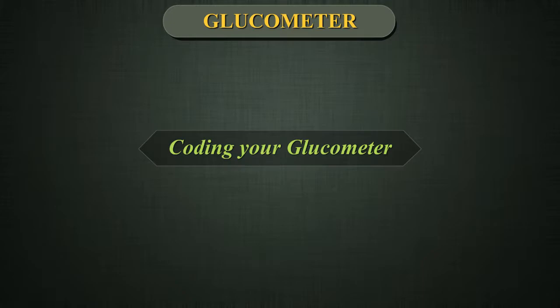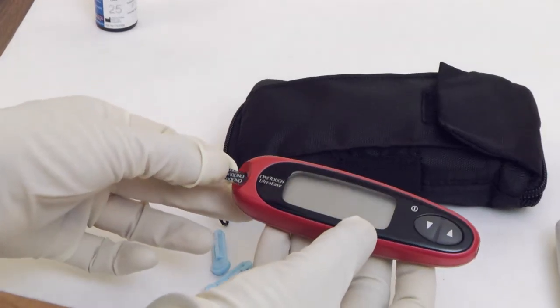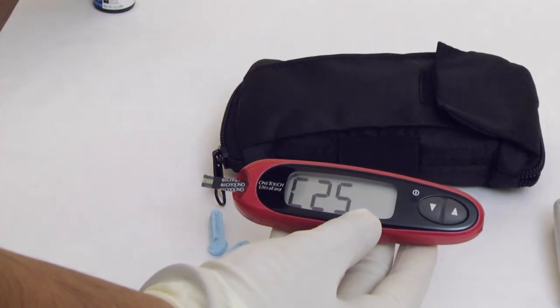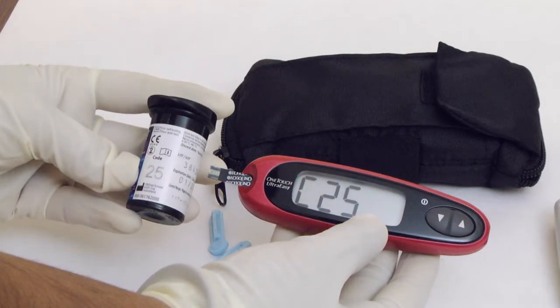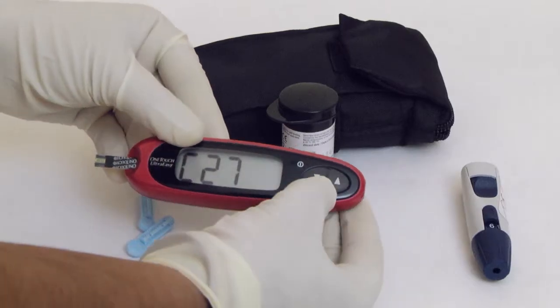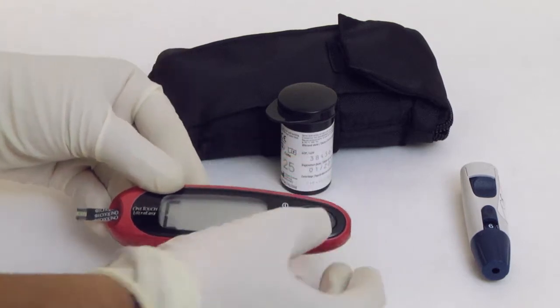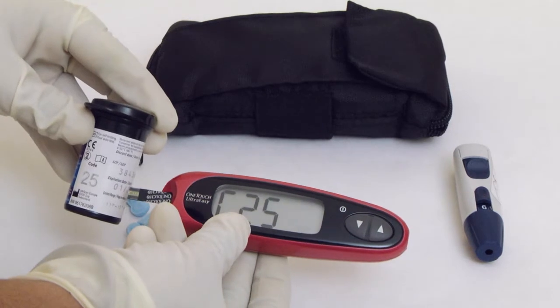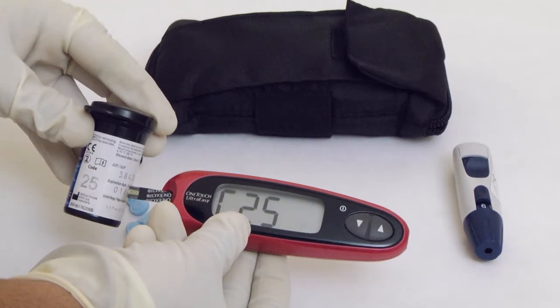Coding the glucometer. Check the code on the test strip vial before inserting the test strip. Code numbers are used to calibrate your meter with the test strips you are using to obtain accurate test results. You must code the meter before using it for the first time, and then every time you change to another vial of test strips.